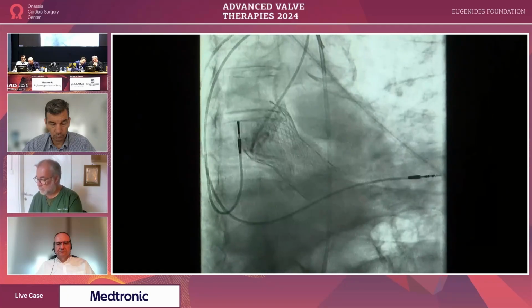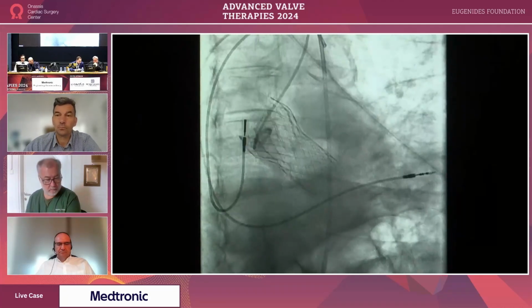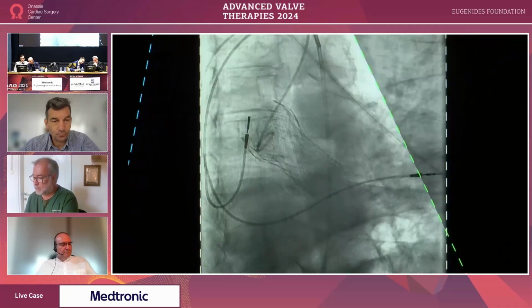Okay. So let's do an echocardiogram and see, but I think I'll be fine with that.